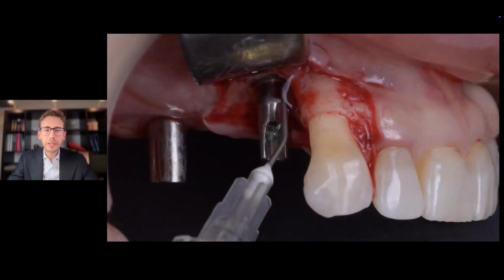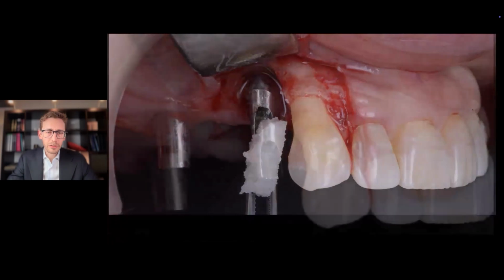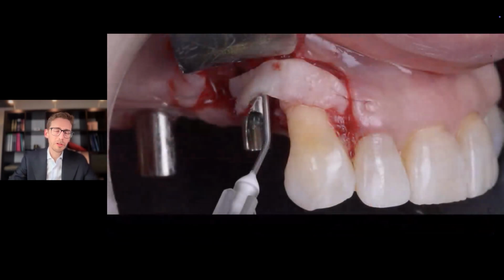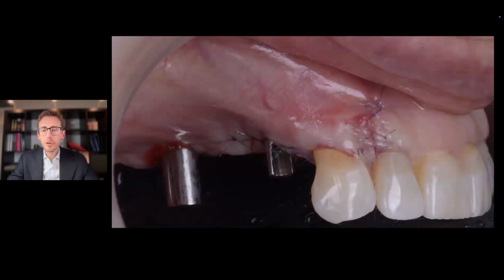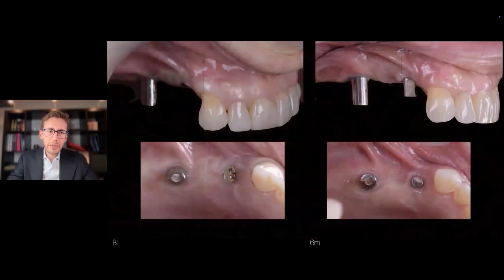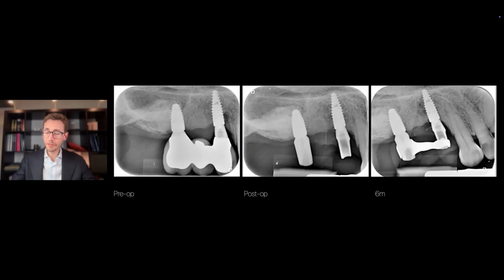A first layer in the regenerative site, in direct contact with the bone defect, the application of Bio-Oss collagen as a reconstructive strategy, the second layer of RegenFast applied on top of the Bio-Oss collagen underneath a connective tissue graft, and finally, a slight coronal advancement of the flap and the watertight first intention closure of the wound around the implant-supported abutment.